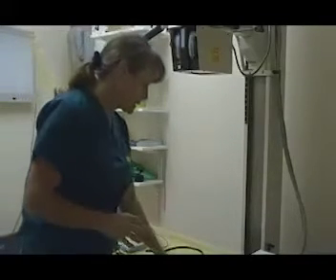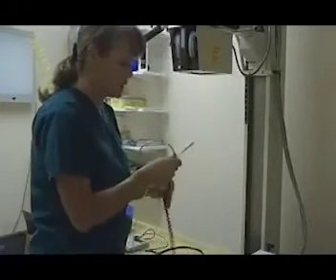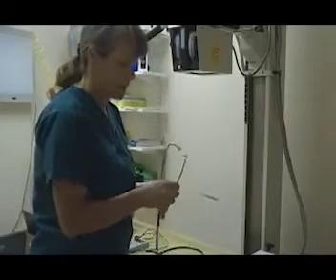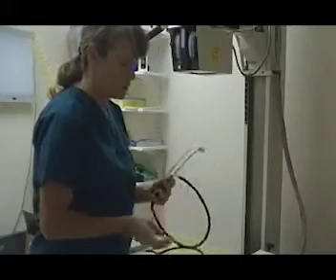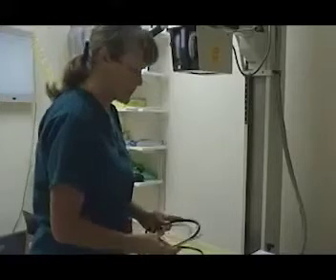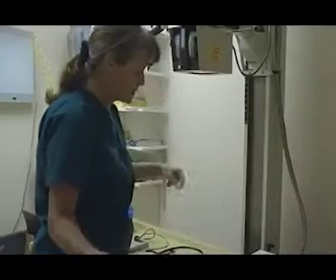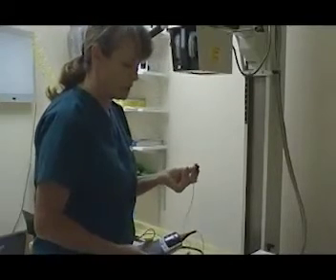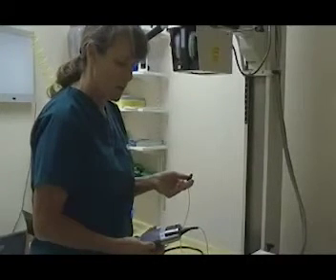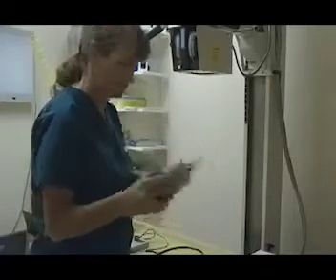The various pieces of equipment that can be used to monitor various vitals. We have an esophageal stethoscope here, which is put into the esophagus of the animal. This can be used to confirm the readings of the ECG and the pulse oximeter on the heart rate. You can actually hear the heart beating through it. The pulse oximeter is clipped to the tongue or the ear of the animal. Generally, you get a better and more accurate reading with the tongue. This gives you your heart rate and your SpO2 percentage, which is your blood oxygen saturation.